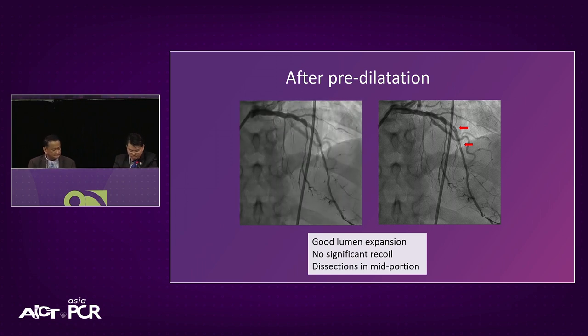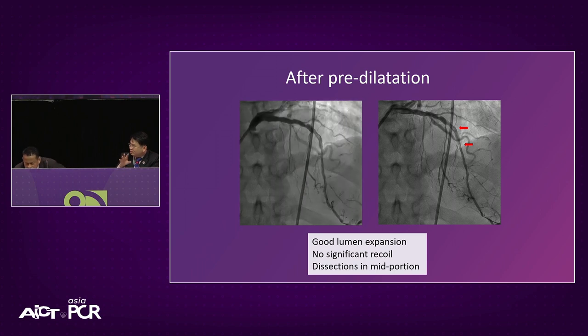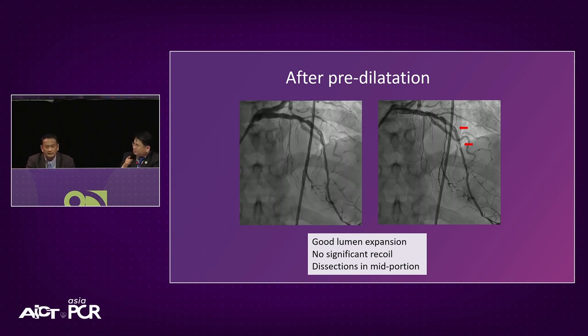Okay, so I think we discussed very well this crucial point, which is when a DCB, you think, is likely to work based on either angiographic or IVUS. One last question back to Rosli: he will go with a more aggressive approach when there's really a dissection rather than try DCB now. Would that predispose you to more dissection and therefore a higher chance of a stent bailout?